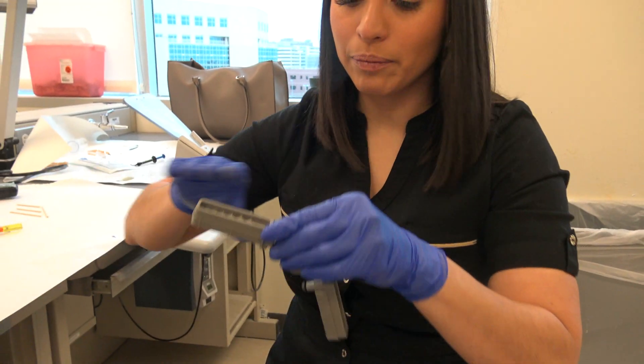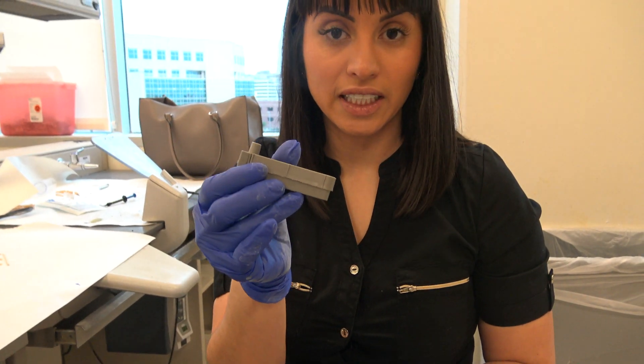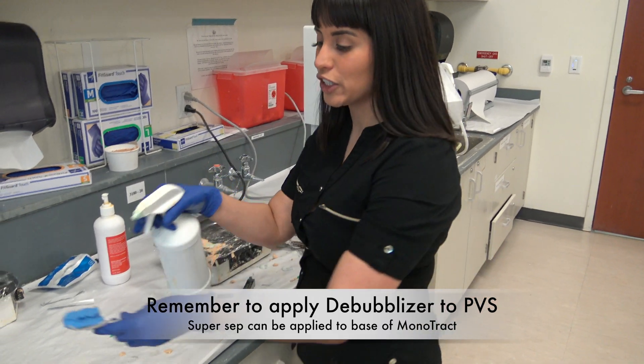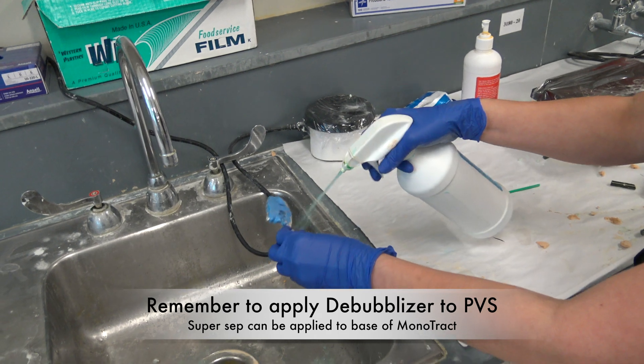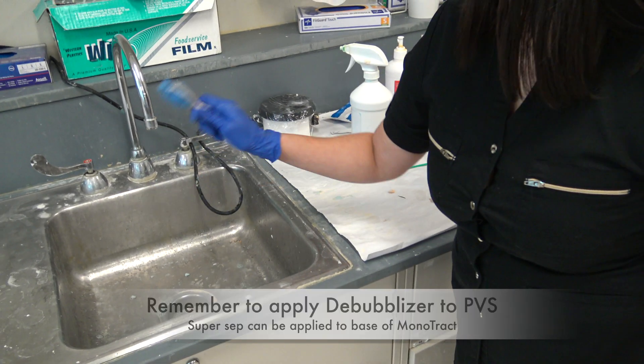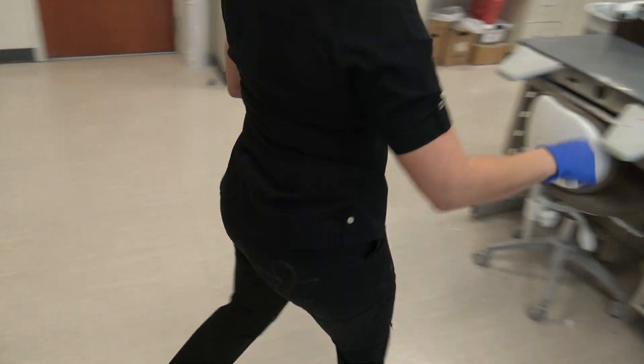When you pour it up, you're only going to pour up one base first, then separate it from the hinge. We're going to spray some debubblizer into it since it's VPS, and then we can blow off the excess.